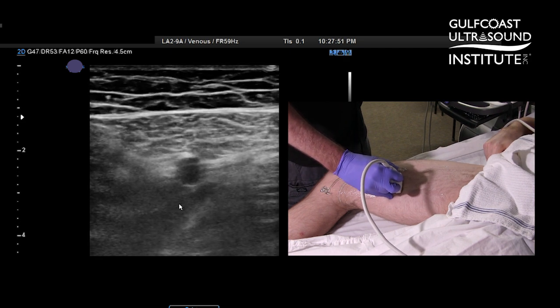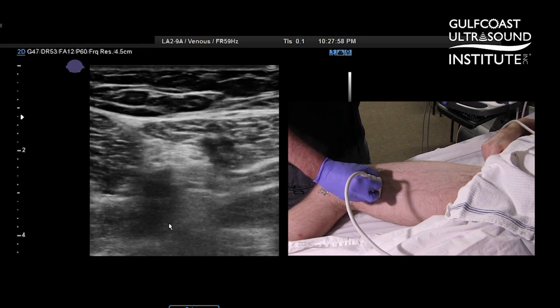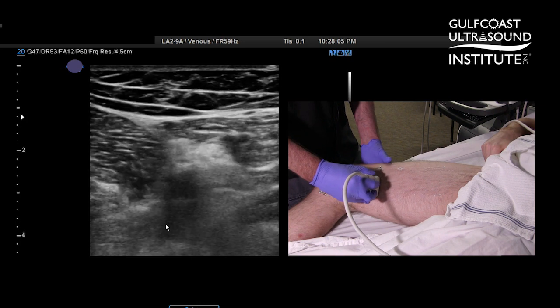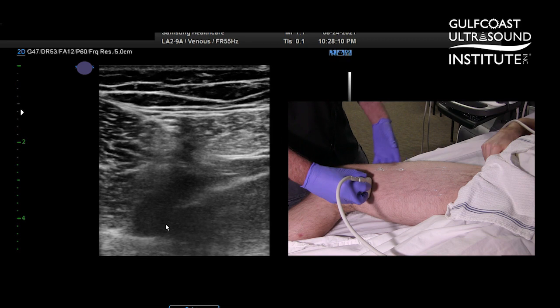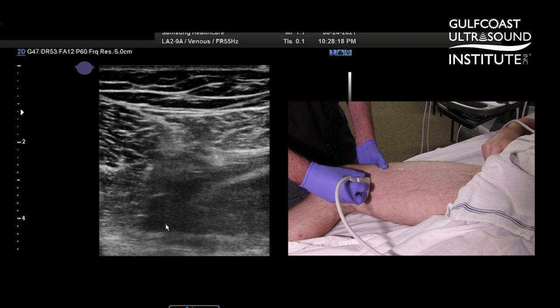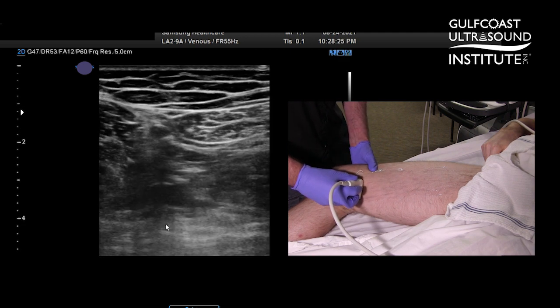A little more difficult to see. We're seeing our compressions right there. As you get distal in the thigh it does get more difficult. A really good tip in this location, as you get down toward the adductor canal when it's difficult, is to just go ahead and reach your hand underneath the thigh and actually push up on that vein toward the transducer — you can see my arrow right there.